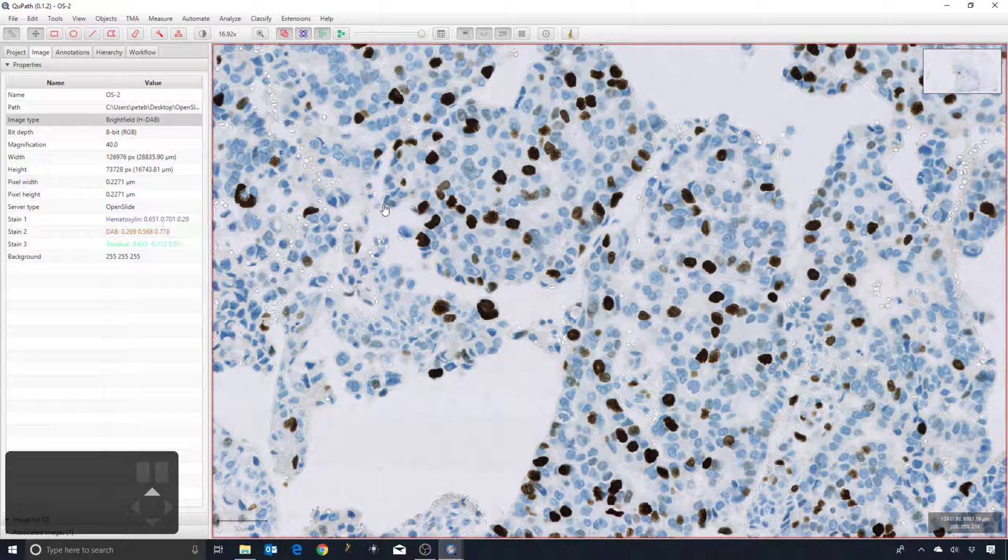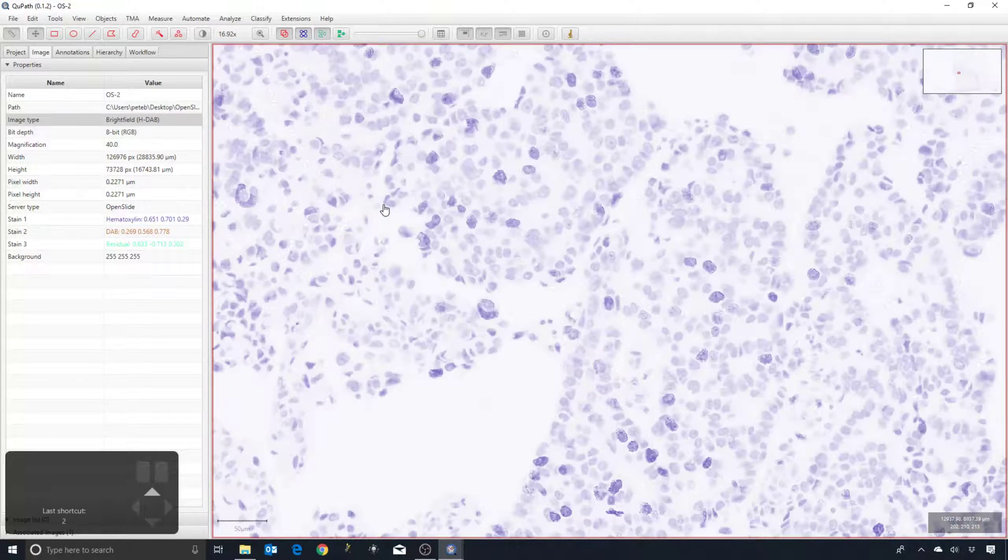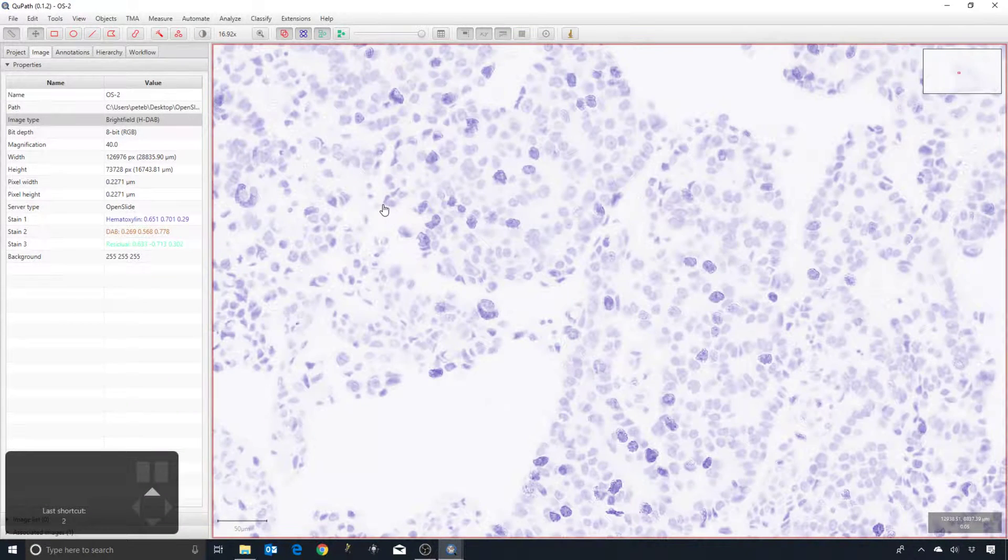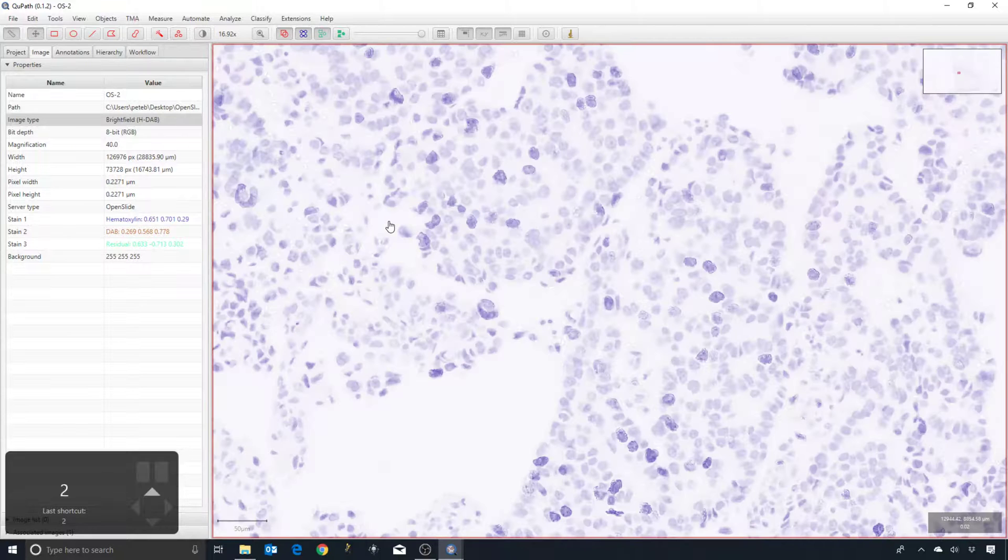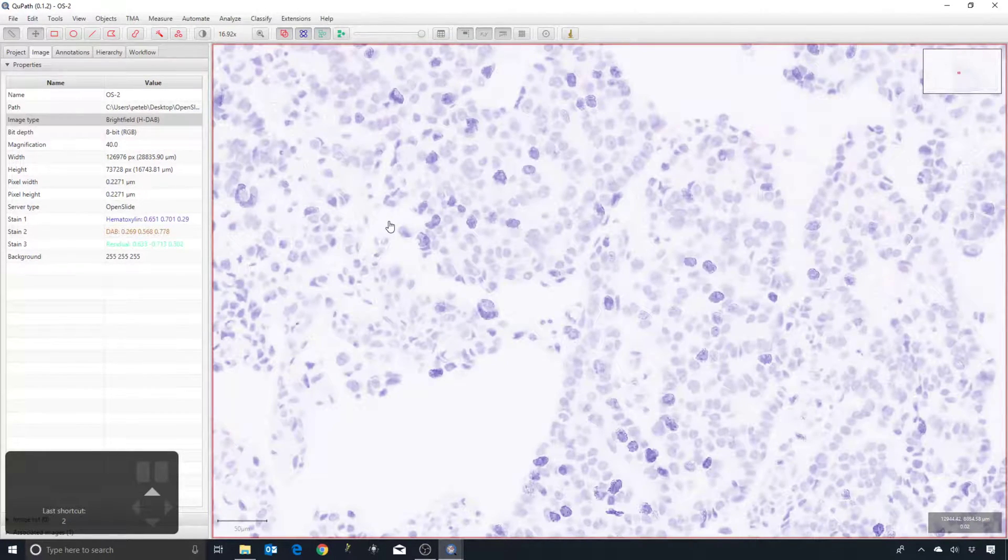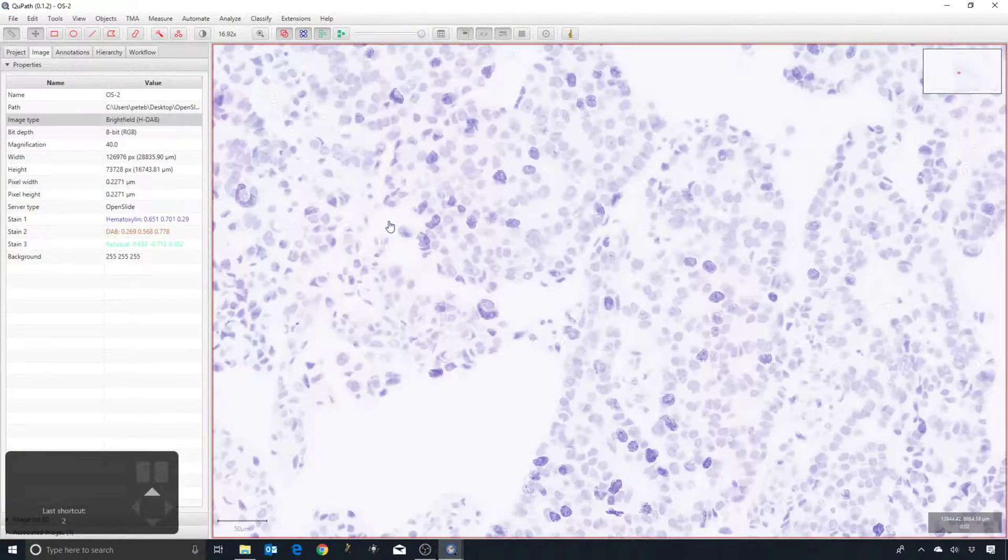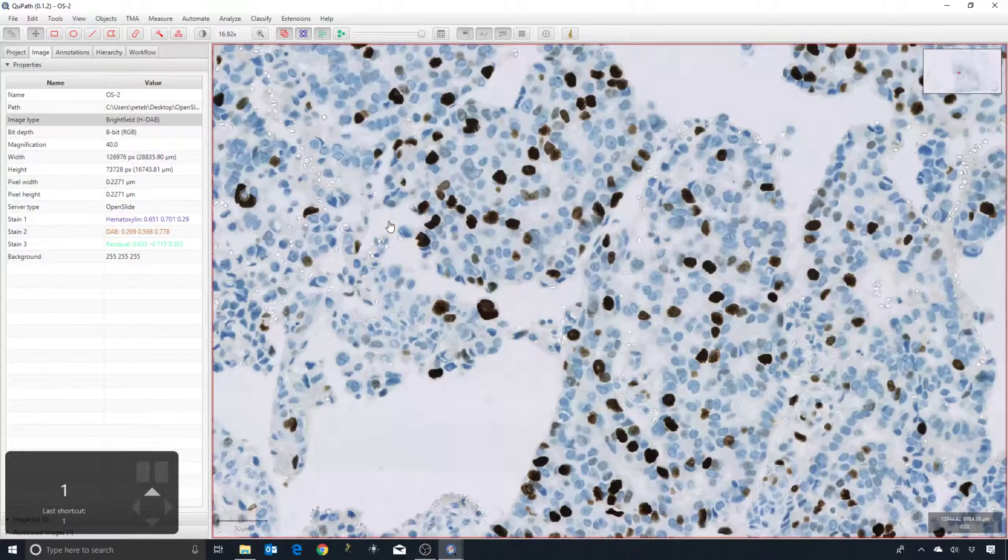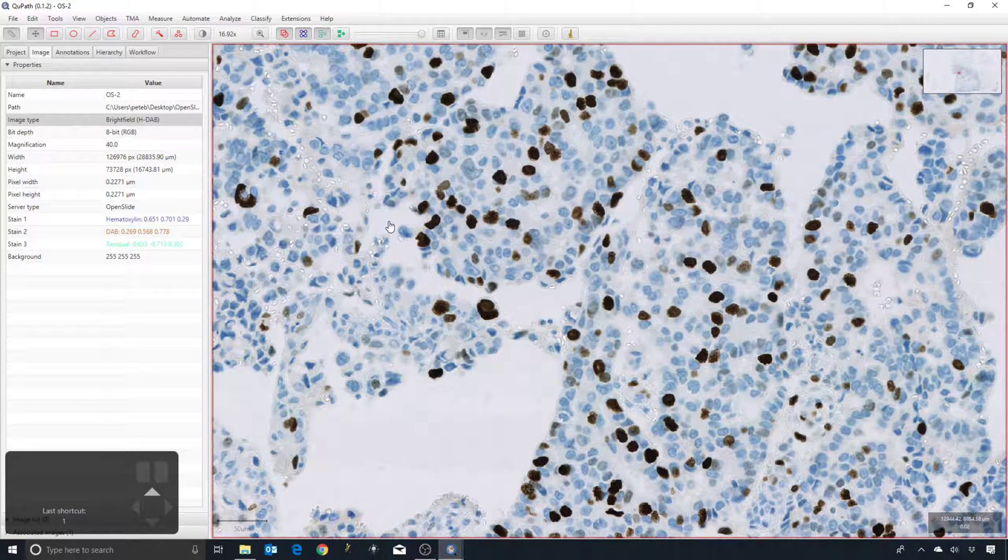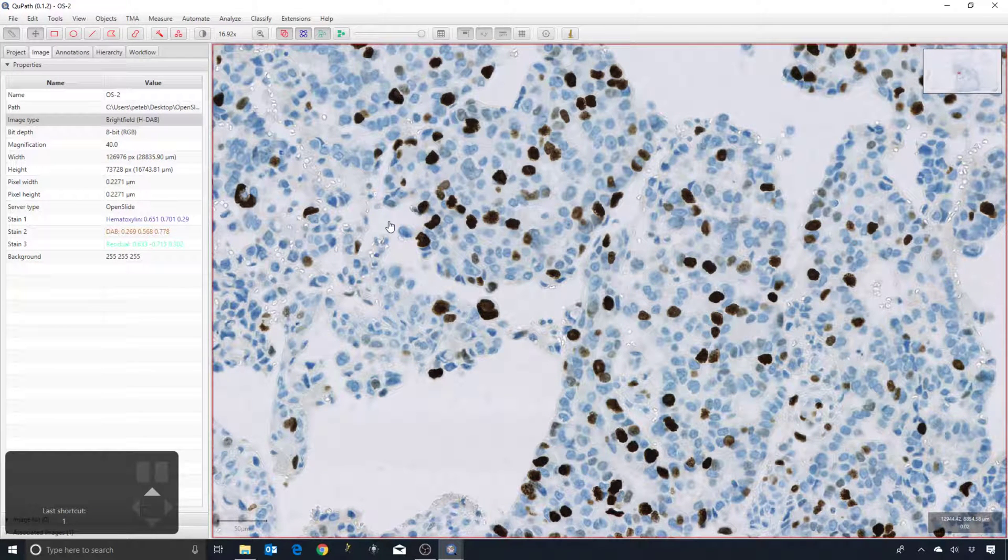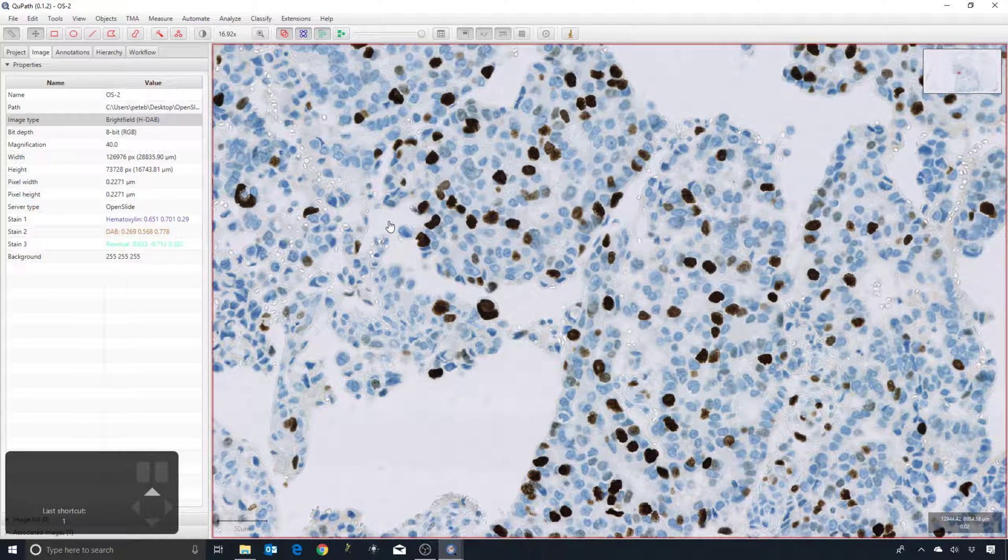I can digitally separate the stains as we saw before, just by typing in the number 2 for hematoxylin and 3 for DAB. They don't entirely relate to the colors we see there, but it does seem to give some kind of reasonable stain separation.